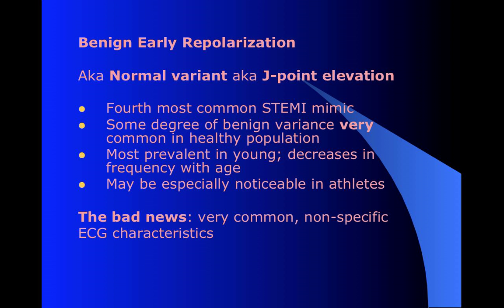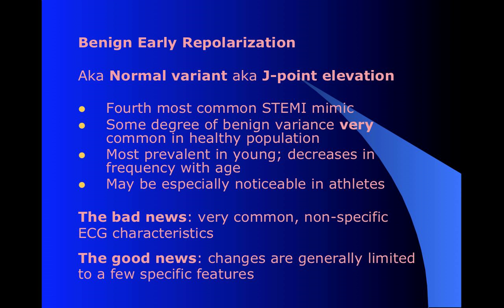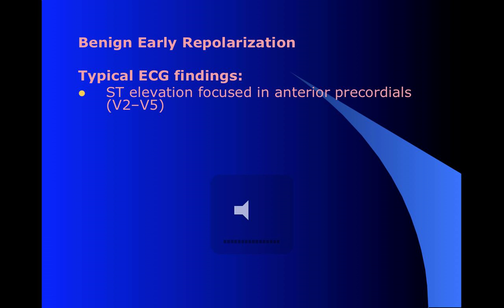The tricky thing is, this is quite common, and it's not real clear on the EKG, meaning there's nothing that will really jump out at you as defining early repol versus an MI. The good news is that although there are certain features it shares with your STEMIs, there's only a few things, and other than that, it shouldn't look like a heart attack.